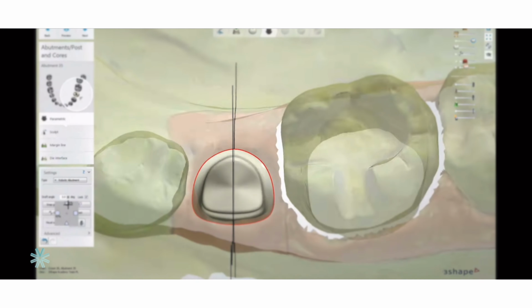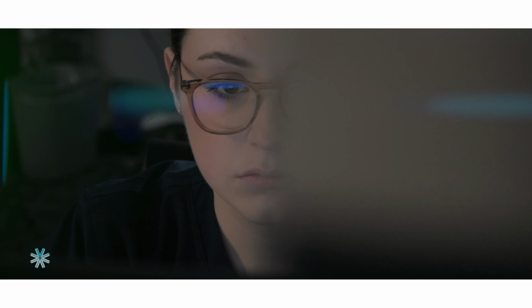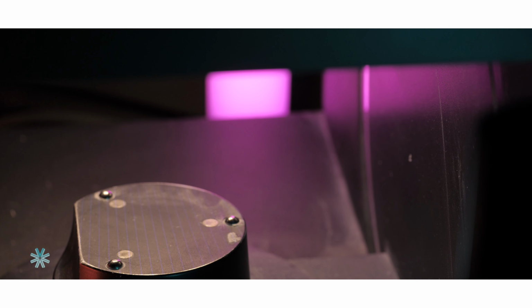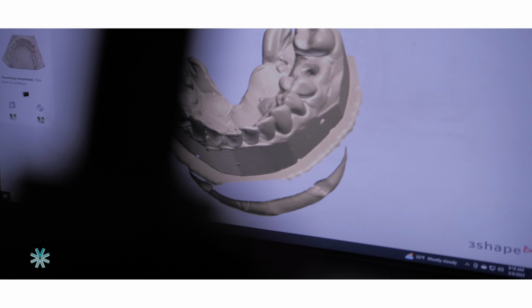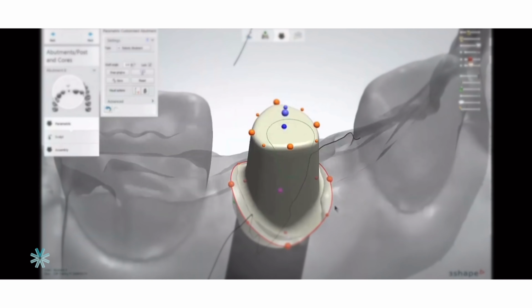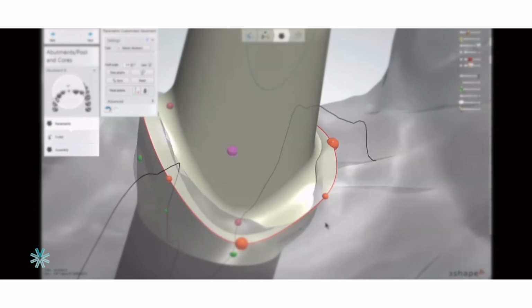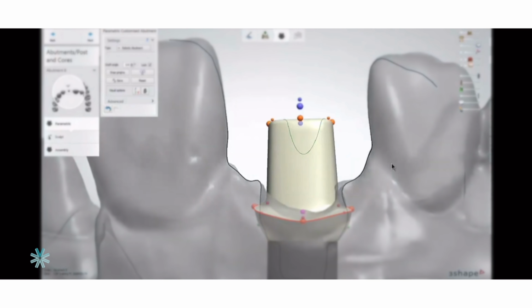What the 3Shape design software allows us to do is survey every detail that could possibly cause an issue. It bold outlines the tissue and the emergence profile, meaning from where the top of the implant interface starts to the top of the gum tissue, right? Most implants are placed subgingival, meaning below the gum line. So that emergence profile, especially right as you start emerging out of that implant interface, it's crucial.